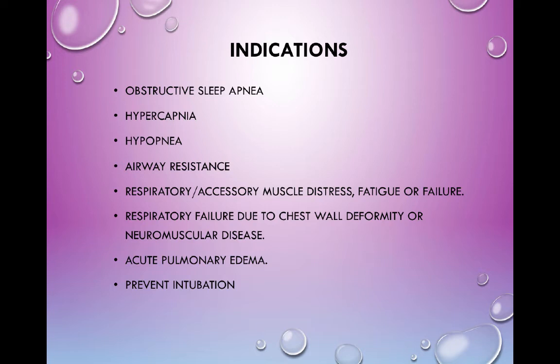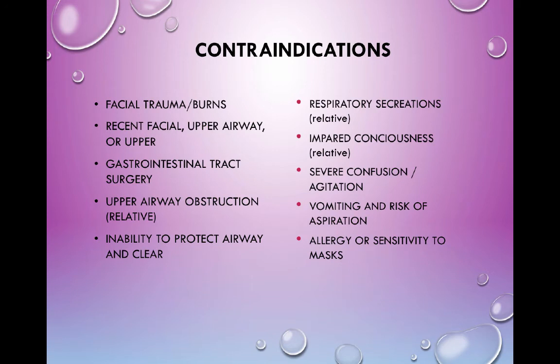So contraindications, a lot of these are relative. I mean, they list some of these as absolute contraindications, but they are all relative. Obviously facial burns, we don't want to cause problems; the masks tend to get sweaty and things like that. We don't want to cause infections if they've got open sores. If they've had recent facial or upper airway surgery, any kind of surgery to their face is a challenge.